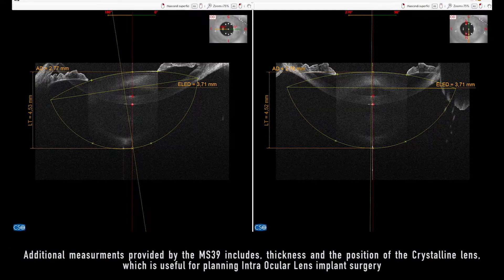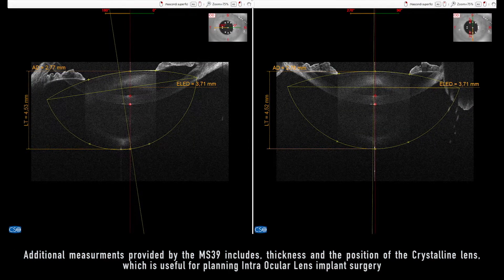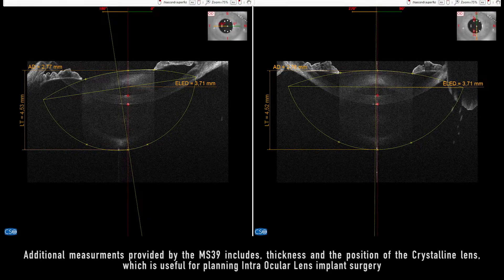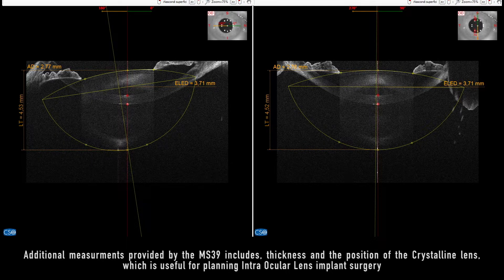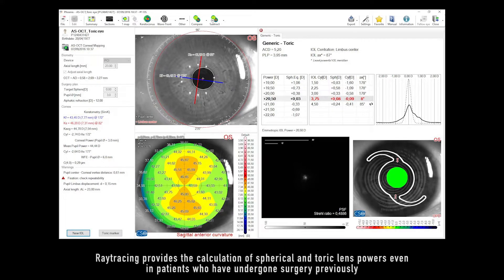Additional measurements provided by the MS-39 include the thickness and position of the crystalline lens, which is useful for planning intraocular lens implant surgery.